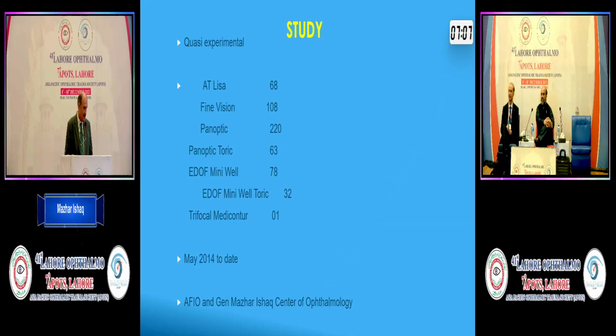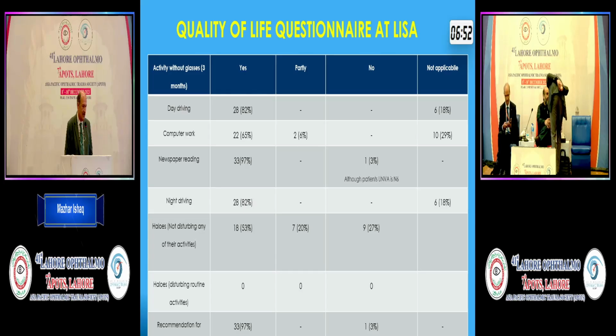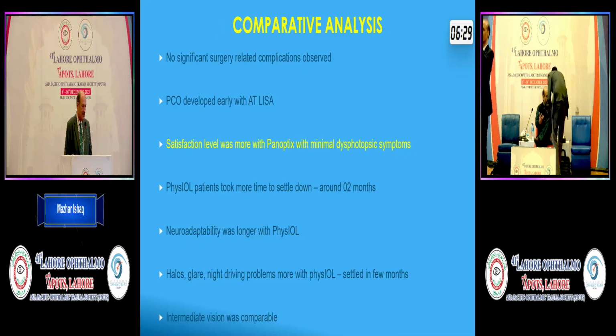What we have been doing is trifocal IOLs, whether it's AT-LISA, FineVision, PanOptix, PanOptix Toric, or EDOF. We have been doing this since 2014, and we have been carrying on with a questionnaire after the surgery, a quality of life questionnaire, which asks about day driving, computer work, newspaper reading, night driving, halos, and how they recommend it. I started that questionnaire in 2014 and have been carrying it on. When we did a comparative analysis, there was not much difference between all the IOLs.